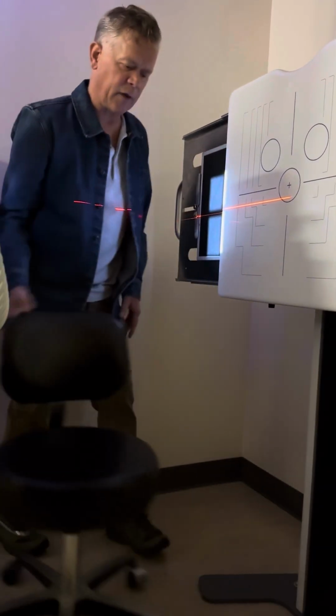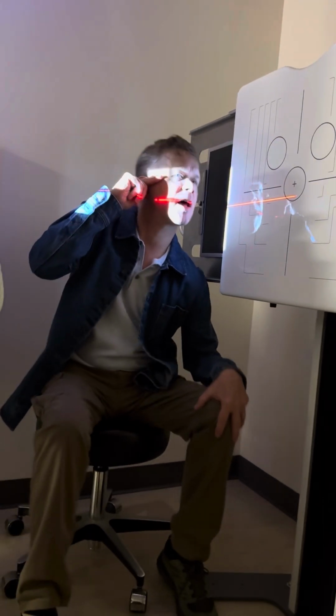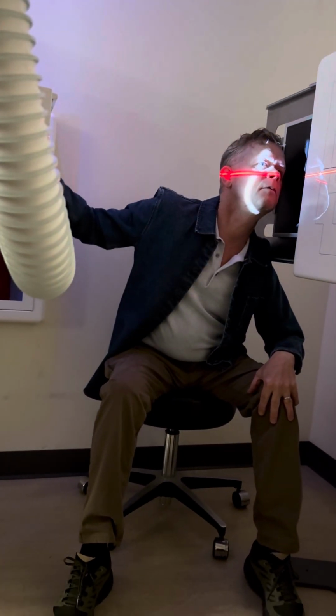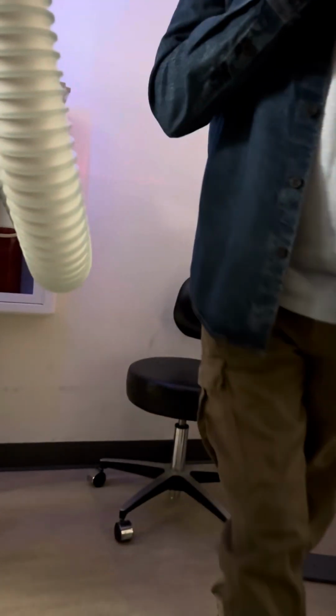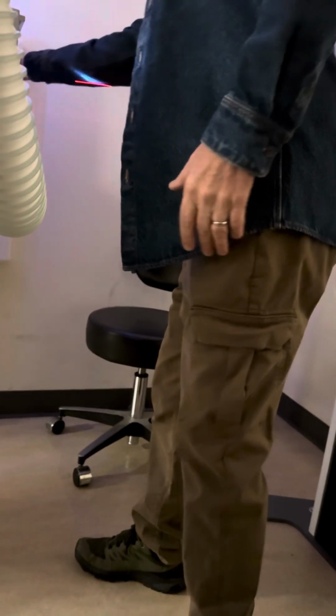And we do bilateral. So we set up for the IOML. I don't know if I'm going to be able to do myself, actually. Almost. IOML, right? The base of the orbit to here. And I just put my nose right there, and then I collimate really down on it, really tightly. So I'm only showing my own nose. And then we take a finger technique to it. And then we do the reverse, because it's always bilateral. But on your practical, you'll only do one view of it. So that's the concept. I have it a little too tightly collimated, but barely. Doesn't take much at all.